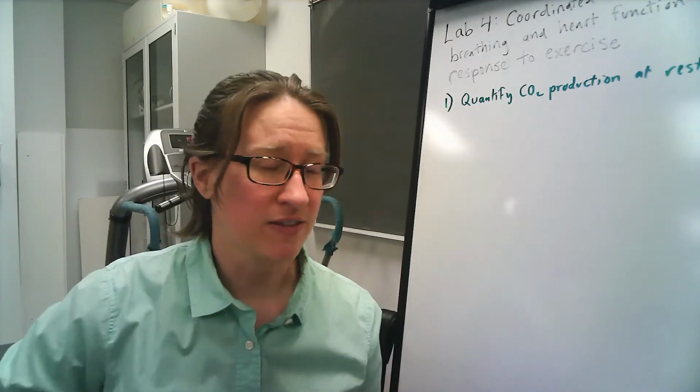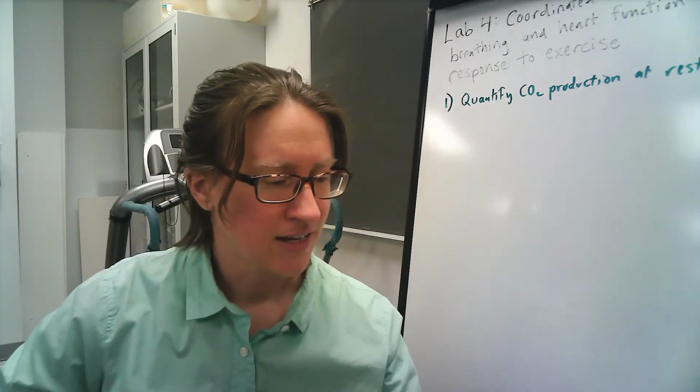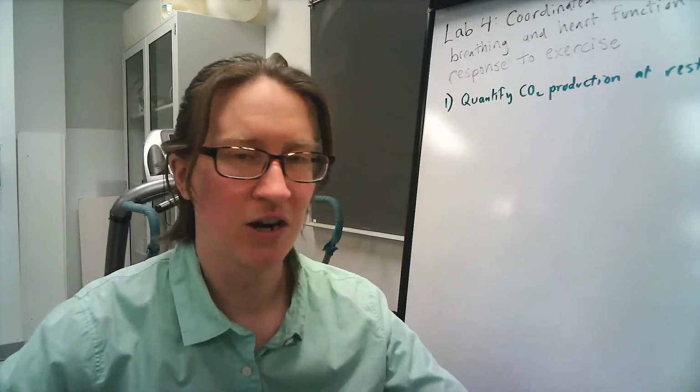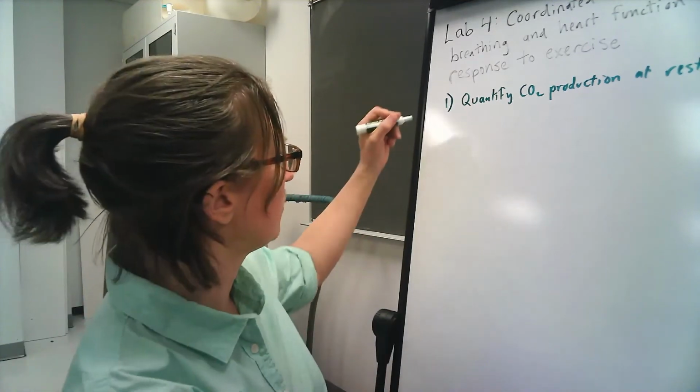The next part of this lab involves characterizing breathing and cardiovascular responses to changes in carbon dioxide and oxygen.